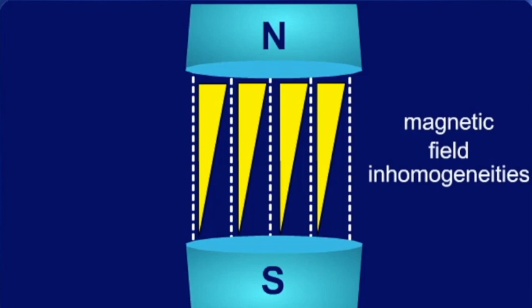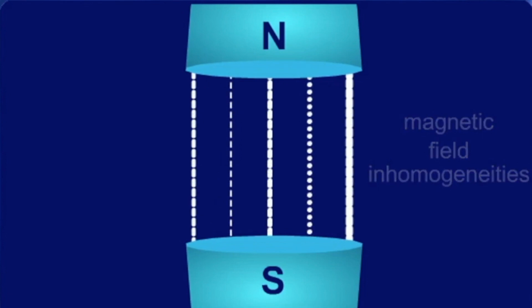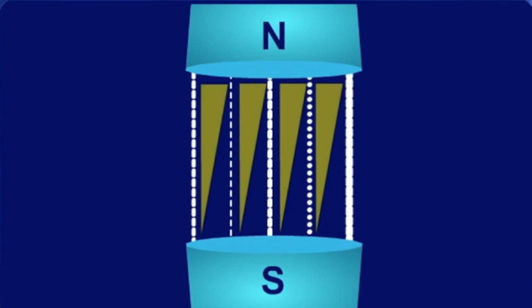The magnetic field inhomogeneities that already exist at that time are due to inhomogeneities of the external magnetic field and the internal magnetic field inhomogeneities inside of the tissues, which we talked about earlier. If you can't remember this, go back to section 12 to recap. Due to these larger magnetic field inhomogeneities, transversal magnetization, and thus the signal, disappears faster.